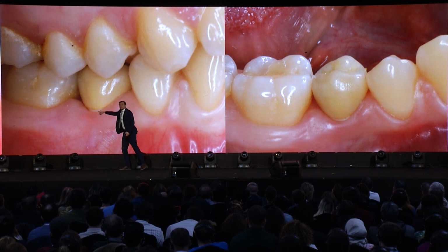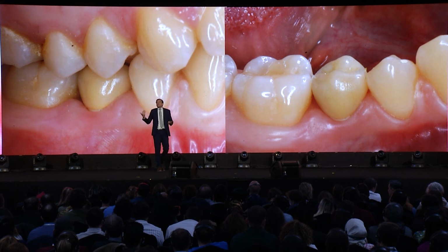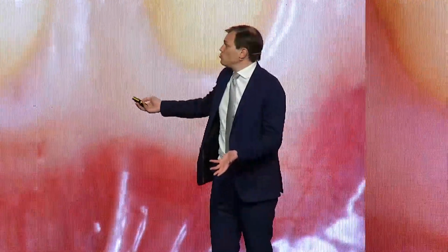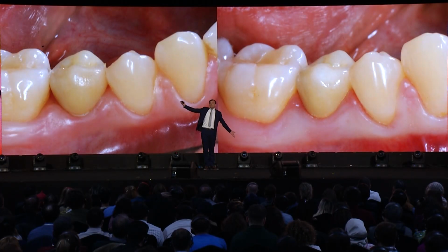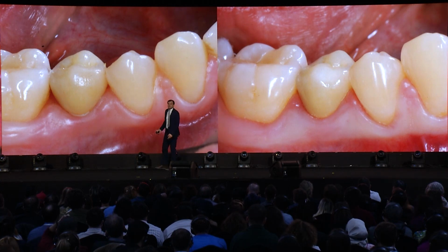But anyway, so is it good? Is it bad? What to do? So I said to the patient, okay, let's wait. Because when you don't know what to do, you always say, let's wait. And the patient comes after half a year, and this gap disappeared. Now, if you don't remember, it looked like this before. This is after half a year. So the tissues just grew, and they closed it.